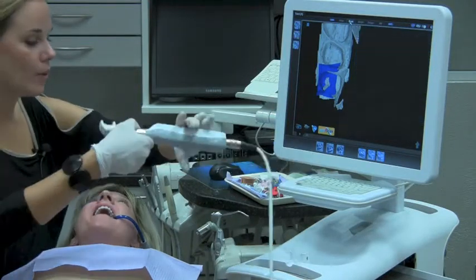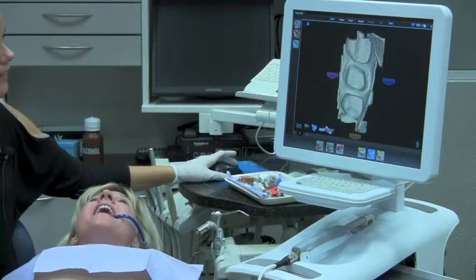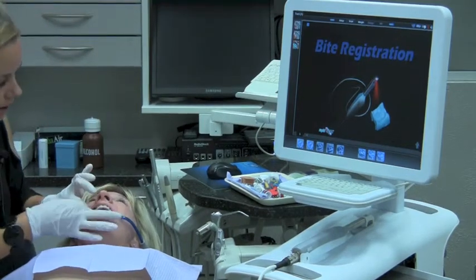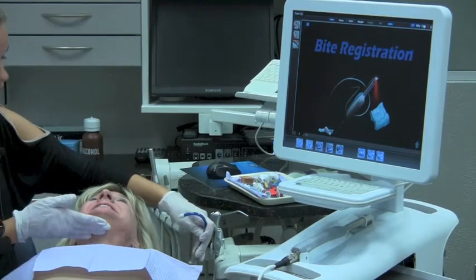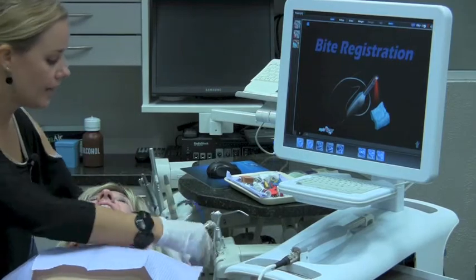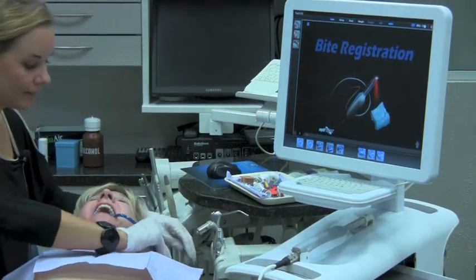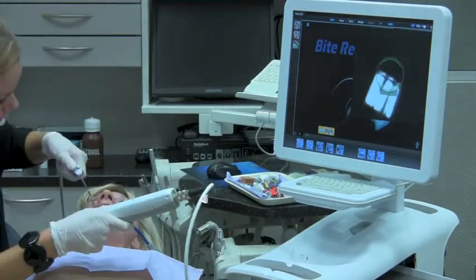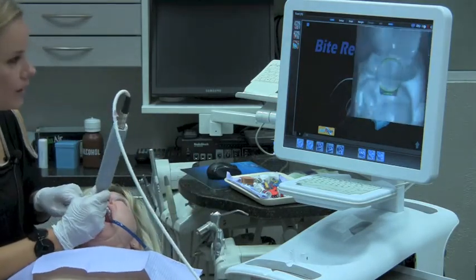So now I'm ready to capture my bite registration. All I need to do is click on the Bite Scan tab, and now we're ready to capture our impression of our opposing via the bite registration. I have Terry closed into the bite registration just to ensure that it's still good, and then we're ready to scan the bite. I'm going to activate the camera and capture the bite registration. I like to start over the distal most tooth and then move mesial.